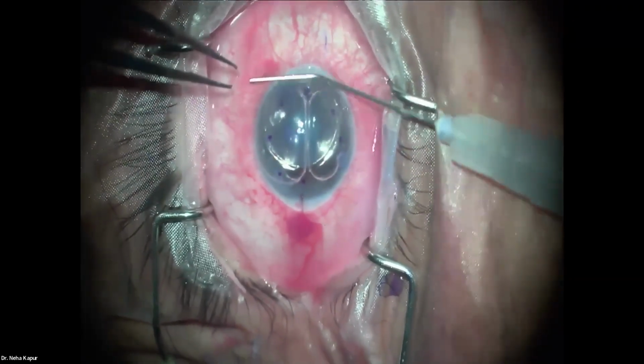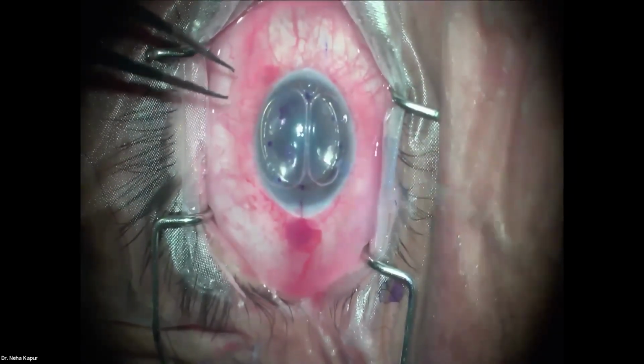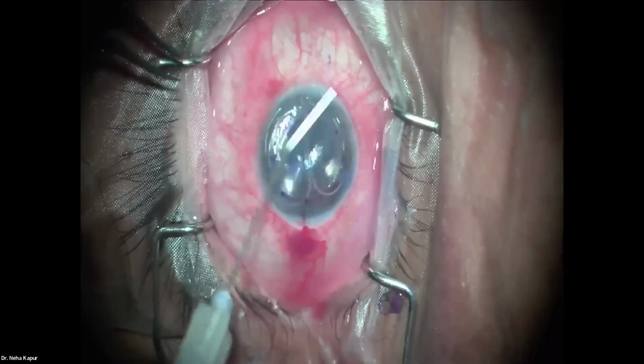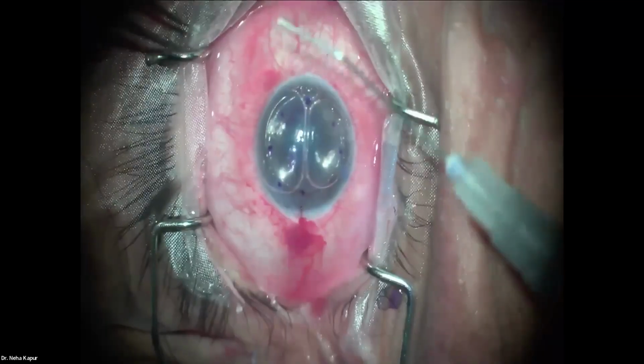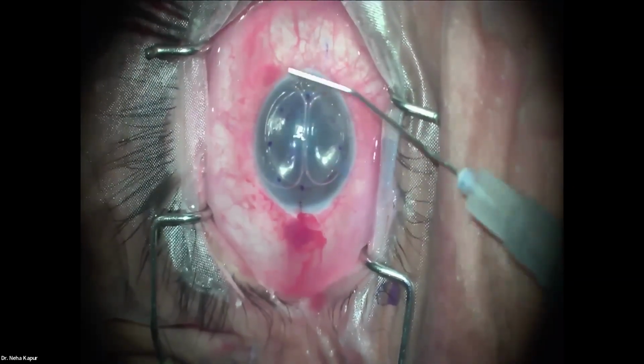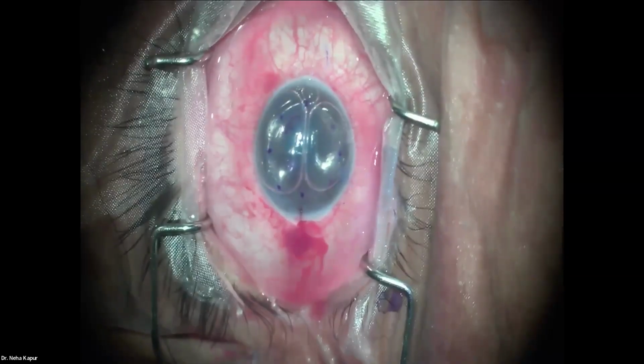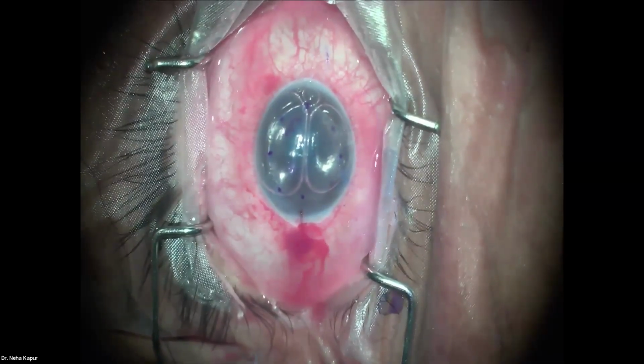You can see the lenticule is moving freely. It's almost come to the center, just a little short. It's good to be patient. It will come in place. And now it is exactly where we want it to be. But the eye is not tight enough. We want air filled tighter. There, air.